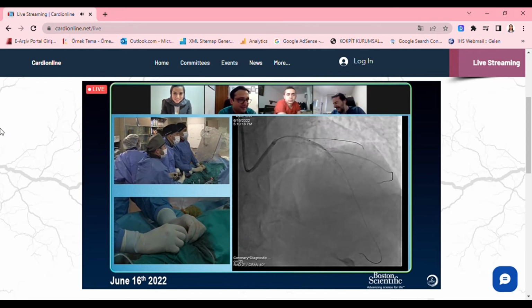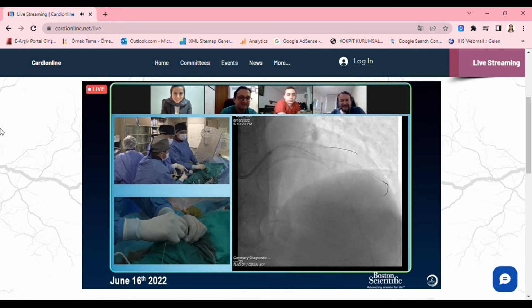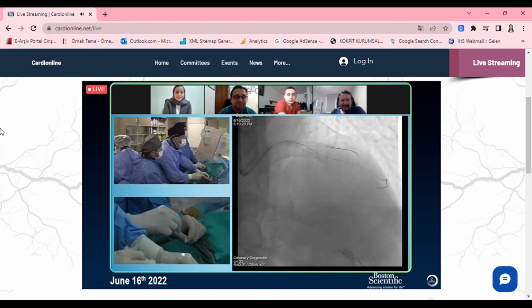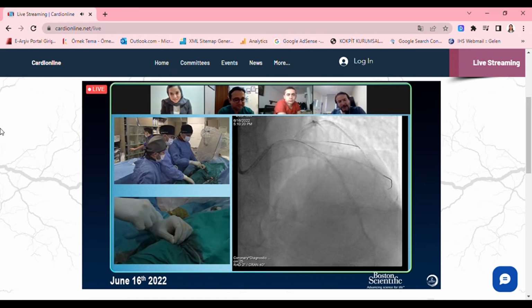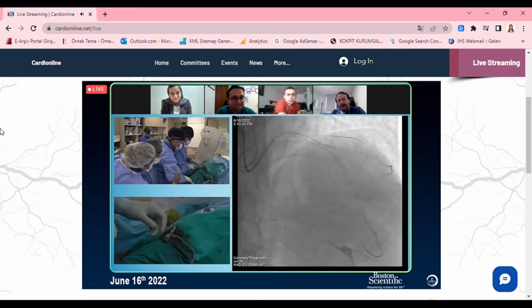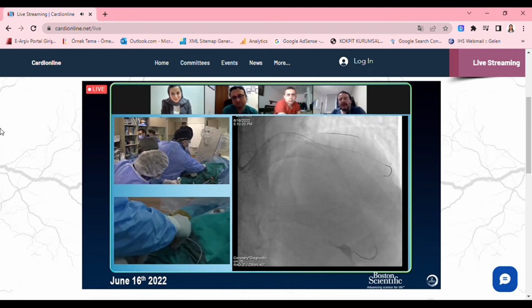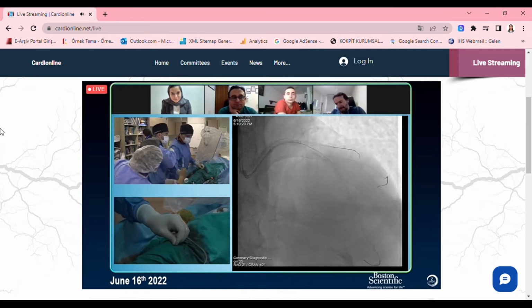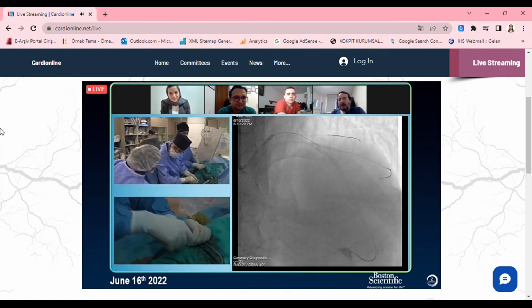And he already said he's not great. Wow. Ruptured. What type? So ruptured at 20, right? Yes. Okay, this is a good sign. No problem. It's a good sign that you need more plaque modification. So that was the reason why I wanted to see the IVUS after Rota. Maybe we would have gone directly with the scoring balloon before the NC.